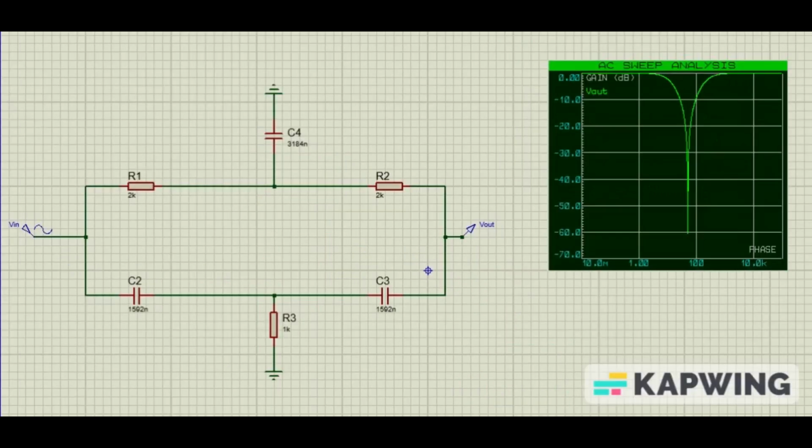In the next step, we go to designing the notch filter. A notch filter is a type of filter that removes a specific frequency known as the center frequency. So after removing all frequencies outside the ECG signal range, we need to remove any noise that is present within that range. One of the most common types of noise in ECG signal is power line noise, which has a frequency of approximately 50 Hz up to 60 Hz. In our country, it is 50 Hz, so we will eliminate the 50 Hz frequency. Since this frequency falls within the band-pass range, we can use a notch filter to eliminate it.